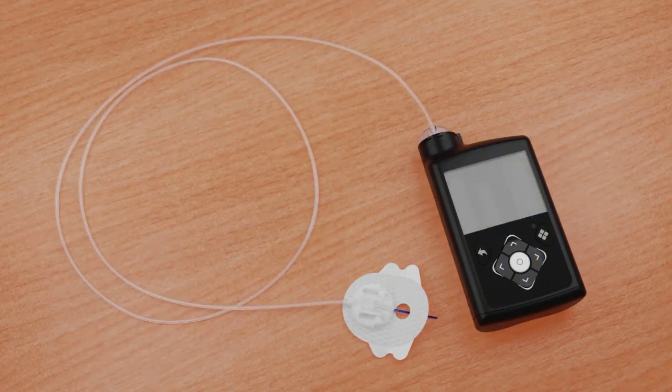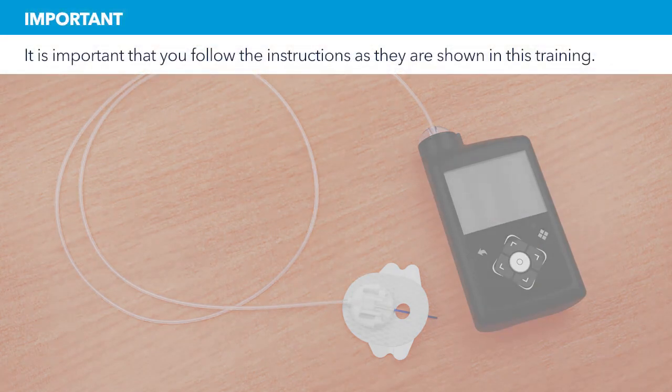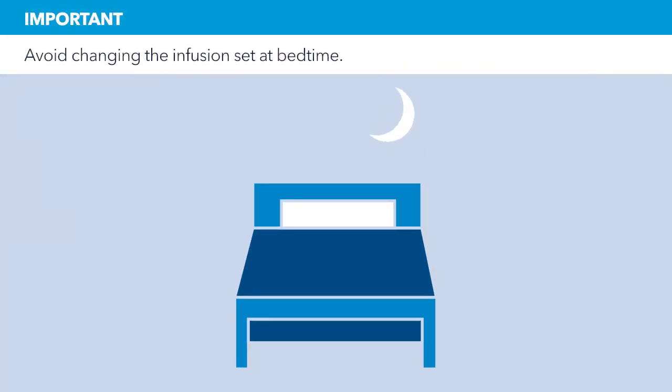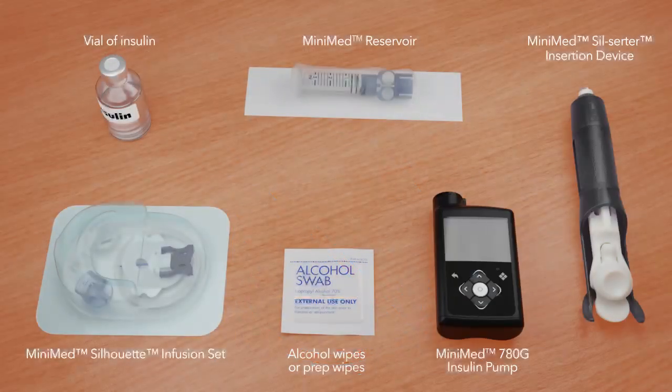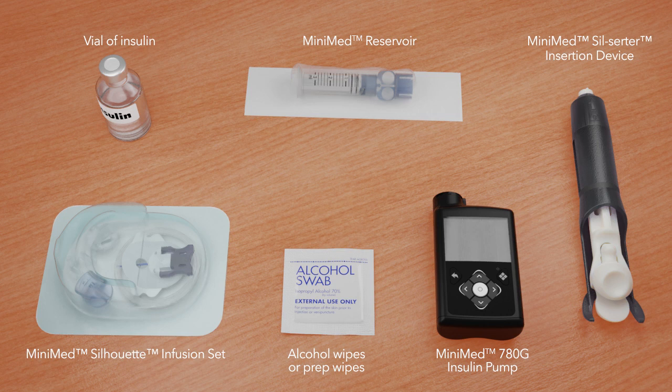This video will show you how to fill the reservoir and insert the infusion set. It is important that you follow the instructions as they are shown in this training. Try to avoid changing your infusion set before bedtime unless you're able to check your blood glucose 1 to 3 hours after inserting. Before you begin, wash your hands and gather the items you will need. In this video, we'll be using the MiniMed SilSurter to insert the infusion set.